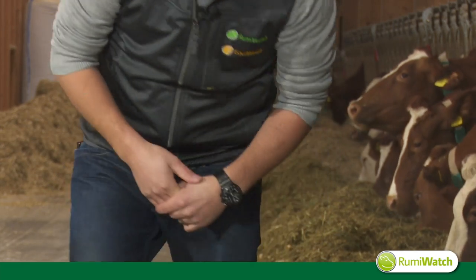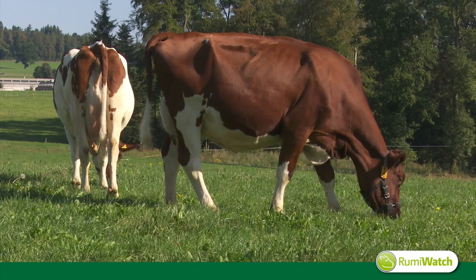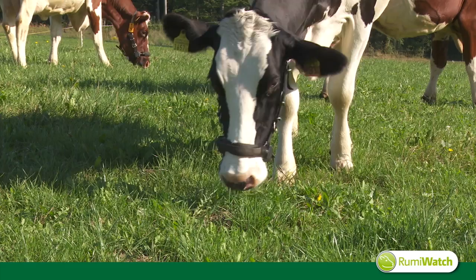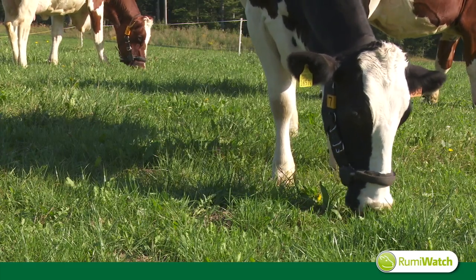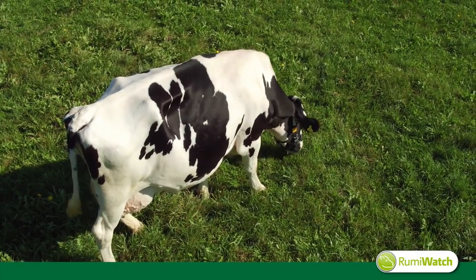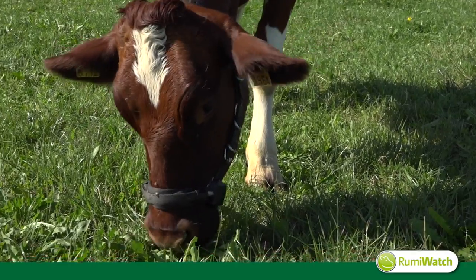So let's go outside to have a look at what exactly the RumiWatch system is recording. Grazing behavior shows variable amplitudes of both the pressure sensor and the accelerometer values. For a closer characterization of grazing, our main question is: what are prehension bites and mastication bites, and how can we tell them apart?